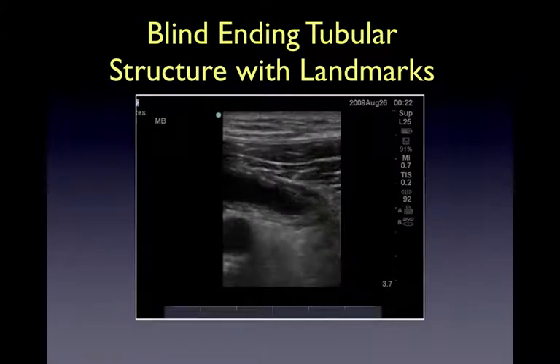This is another picture of appendicitis. In this case, the blind-ending tubular structure is immediately below the peritoneum, indicating excellent graded compression. The structures above the peritoneum are abdominal muscles and overlying skin and soft tissues. And the circular structure underneath the appendix is the iliac artery.